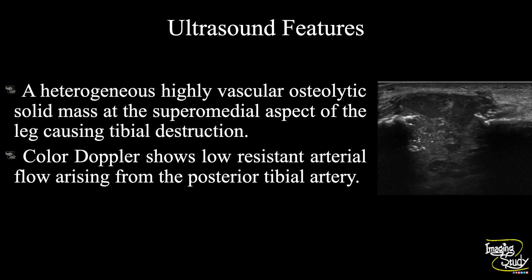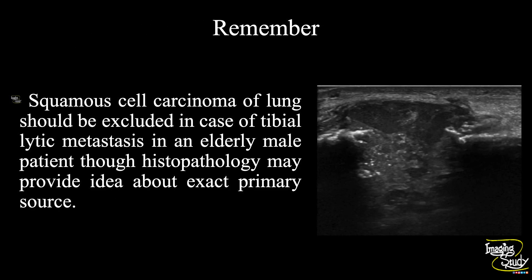In summary, a heterogeneous, highly vascular osteolytic solid soft tissue mass is noted at the supermedial aspect of the leg causing adjacent tibial destruction. Color Doppler ultrasound shows a low-resistance feeding artery arising from the adjacent posterior tibial artery. This suggests a case of tibial osteolytic metastatic deposit. The take-home message: squamous cell carcinoma of the lung should be excluded in cases of tibial lytic metastasis in an elderly male patient, though histopathology may provide the exact idea about the primary source.